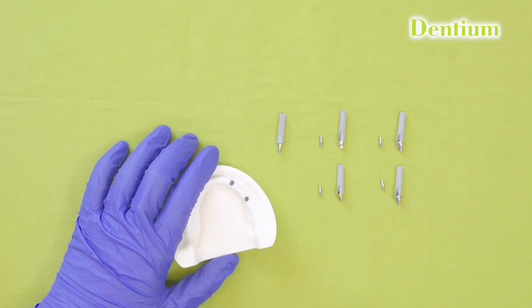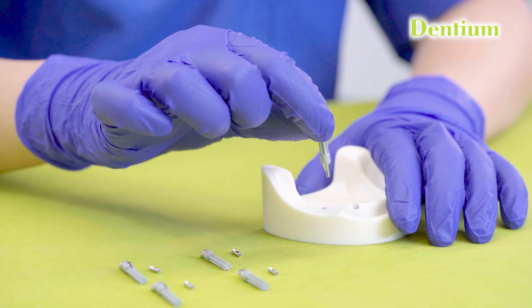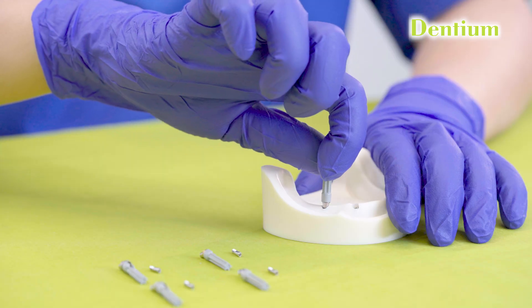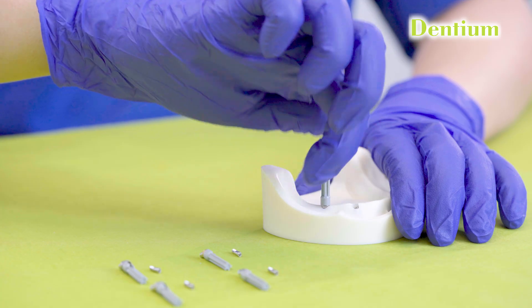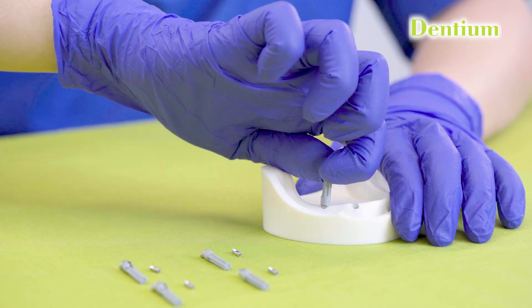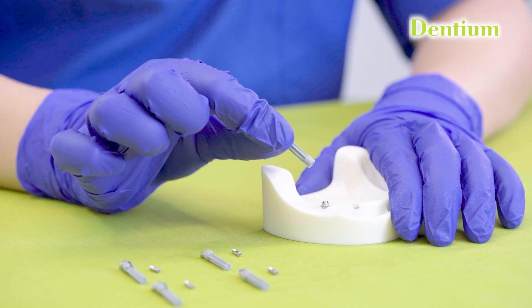Choosing the right multi-unit abutment depends on the angulation of the implant and the prosthetic requirements. Straight multi-unit abutments are used when the implants are well aligned, whereas the angled multi-unit abutments are used to correct the divergences of any implant. A straight multi-unit abutment comes with a delivery holder. I just have to pick up the delivery holder, insert the multi-unit abutment inside the implant, and turn it in a clockwise direction. Once I feel tightening, I will remove the delivery holder.